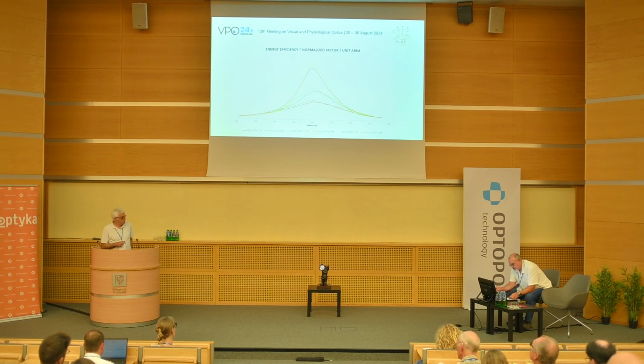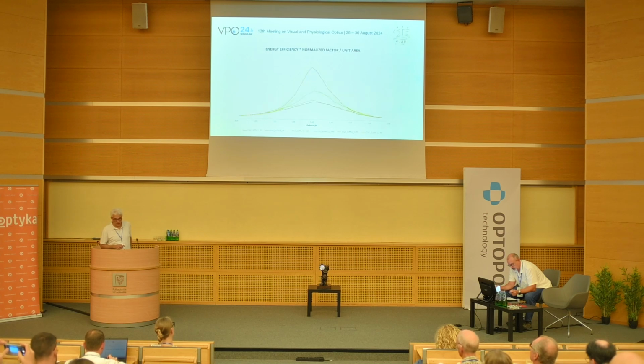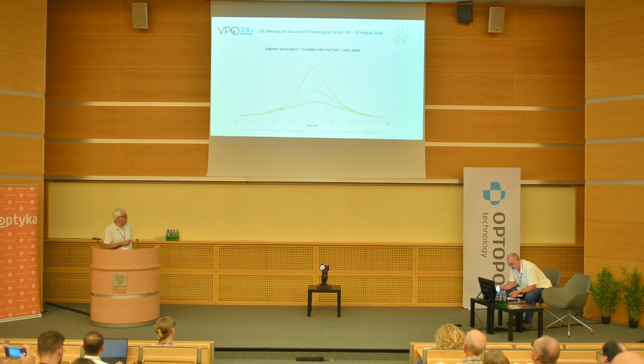We measured that for different powers, these other ones. So for lenses with 3 diopters of astigmatism, here we have just the curves with the factors with the exponent, with 3 diopters, 2.25, or 5 diopters, and they seem to perform in the same way.